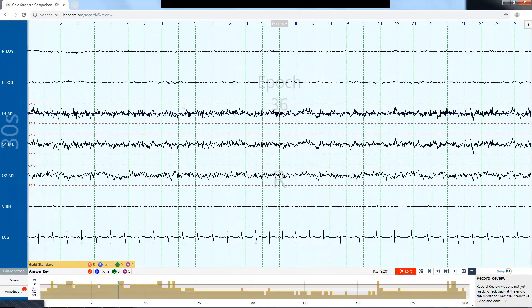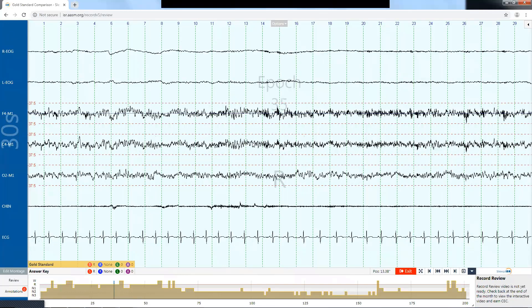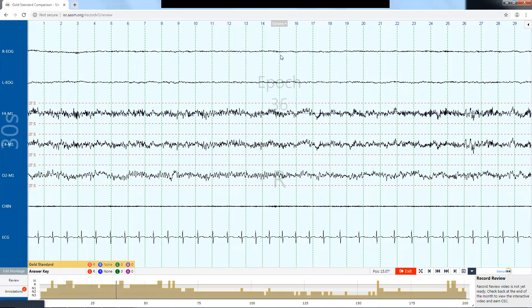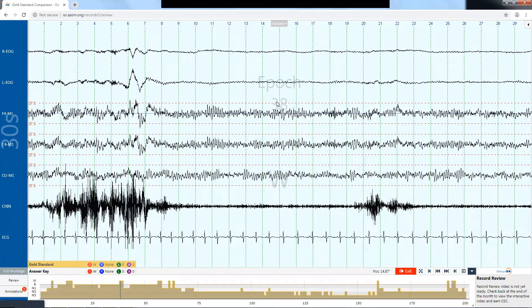Here's another example. Epoch 34: definite stage R with clear rapid eye movements, low amplitude mixed frequency, low chin tone. Looking forward, still low chin tone. Epoch 36 has no eye movements at all — this is the REM continuity rule, where you continue scoring REM until you have some reason to bring the patient out of REM. In epoch 37, the majority of the epoch is REM followed by an arousal in the second half, so the next epoch 38 is wake.